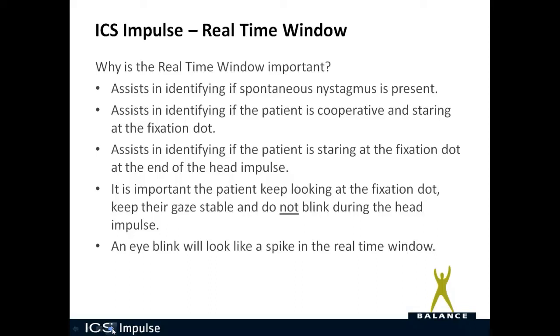It is important the patient keep looking at the fixation dot, keep their gaze stable, and do not blink during the head impulse test. An eye blink will look like a spike in the real-time trace window.